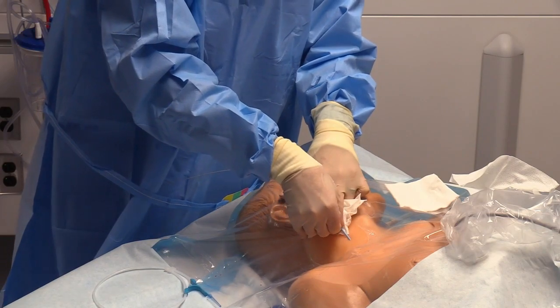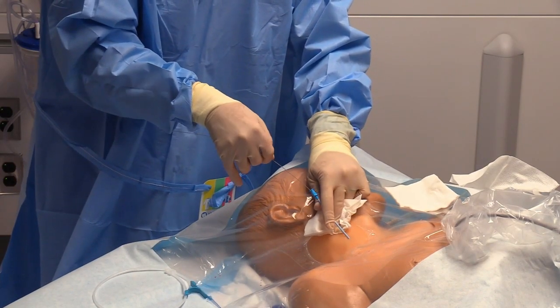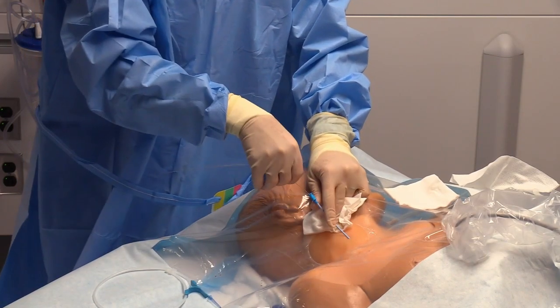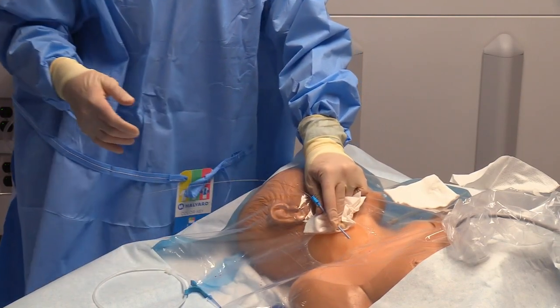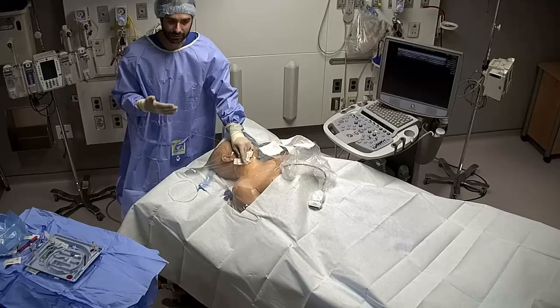As I dilate, I slowly twist and turn. I like to grab my wire behind and make sure that my wire still moves freely. Dilate a little bit more, make sure my wire still moves freely. Dilate a little bit more, and make sure my wire moves freely. With a triple lumen, I may not do that, but with bigger, larger catheters, I will definitely do that.